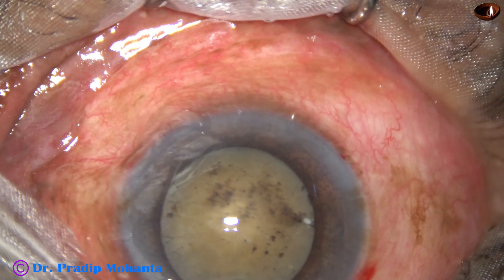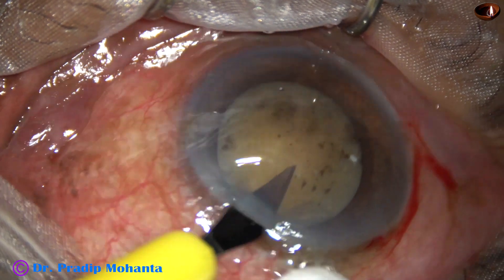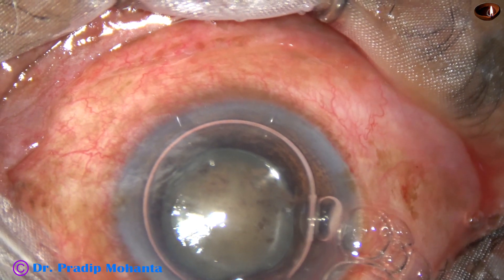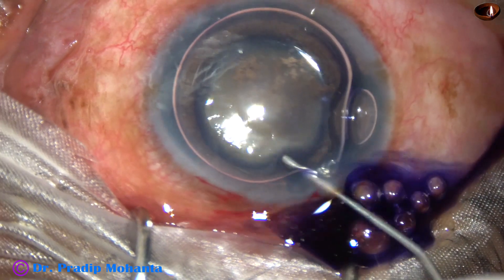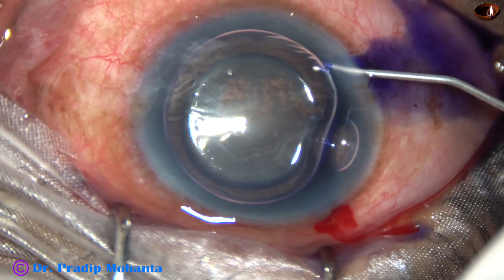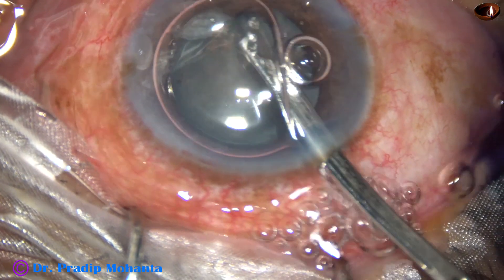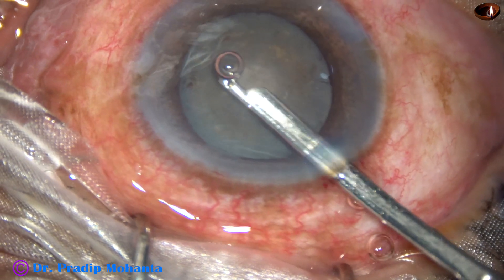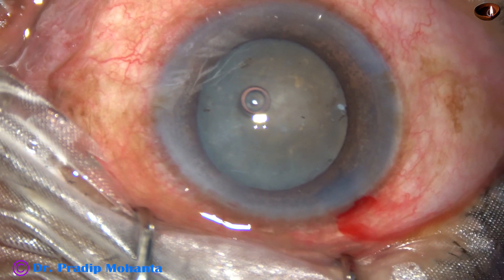By this time, the main incision and two sideports have been made. An air bubble is injected into the anterior chamber, and then trypan blue 0.06% dye is applied over the anterior capsule underneath this air bubble. This is a little bit of adrenaline to keep the pupil dilated during surgery. I wash the dye out, and at this time most of the pigments sticking to the back surface of the cornea and over the anterior capsule came out. Visibility became much better.